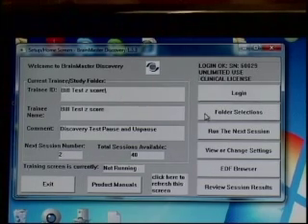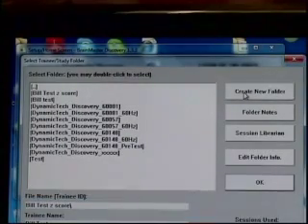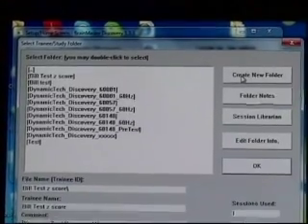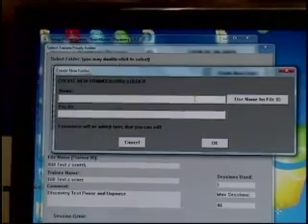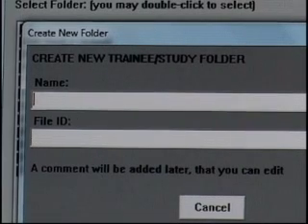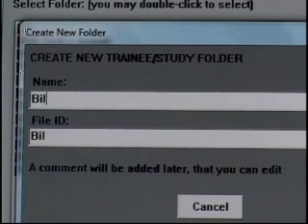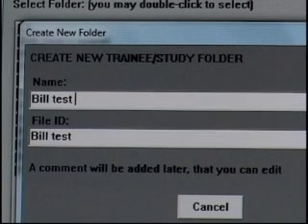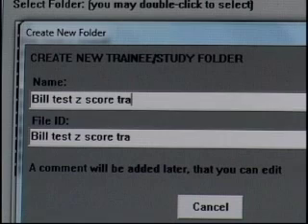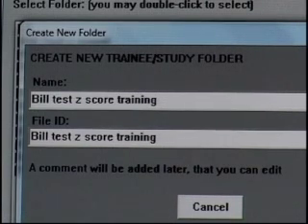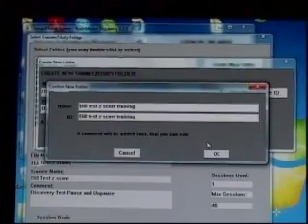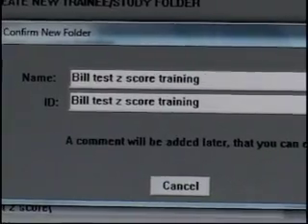First step: folder selection. Let's go ahead and in the upper right-hand corner, create a new folder. We'll name this one — we'll stick with the build test — we'll call this z-score training. We'll hit 'Use Name for ID,' OK, OK one more time.